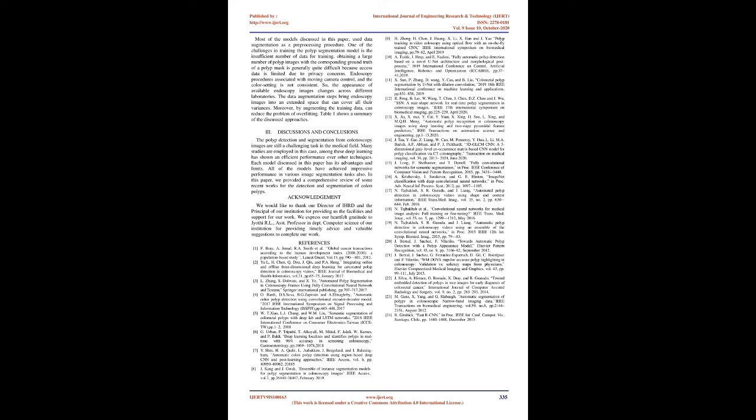Most of the models discussed in this paper use data augmentation as a pre-processing procedure. One of the challenges in training the polyp segmentation model is the insufficient number of data for training. Obtaining a large number of polyp images with the corresponding ground truth polyp masks is generally quite difficult because access to data is limited due to privacy concerns. Endoscopy procedures are associated with moving camera control, and the color setting is not consistent. So, the appearance of available endoscopy images changes across different laboratories. The data augmentation steps bring endoscopy images into an extended space that can cover all their variances. Moreover, augmenting the training data can reduce the problem of overfitting. Table 1 shows a summary of the discussed approaches.